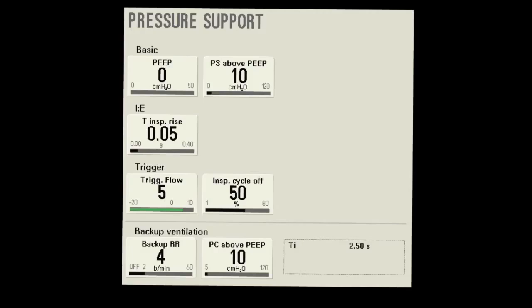Before I describe the intelligent targeting scheme in SmartCare pressure support, let's look at the basic mode, pressure support. So with pressure support, it is actually classified as pressure control, continuous spontaneous ventilation, and the targeting scheme it uses is a set point, so I'm just going to make a small s here. That's where the operator has to set all control variables. They have to set all the set points.